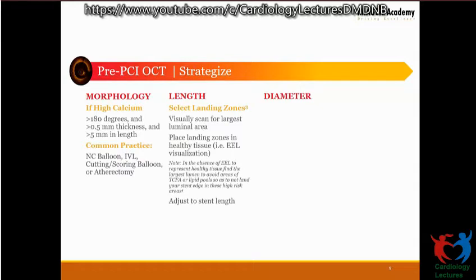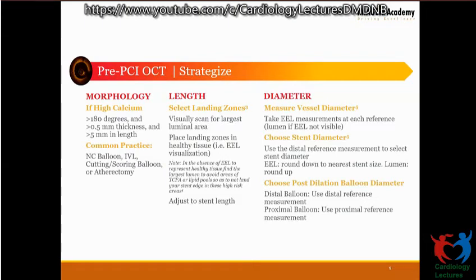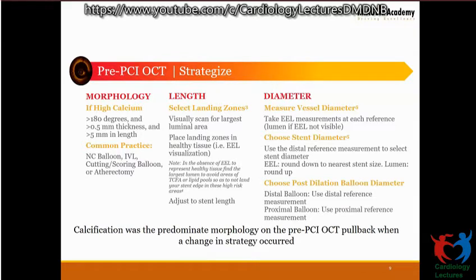The length of the lesion is equally important, and so is the diameter. We had discussed yesterday that we need EL-based measurements, and this is what ILUMIEN III taught us, because ILUMIEN was based on the lumen-based diameter, wherein they found that these are a little smaller. So the ILUMIEN III study used EL-based diameter assessment of the vessel, and the results were pretty optimal. As we go down, we'll be seeing through the case samples how one uses the EL-based diameter.